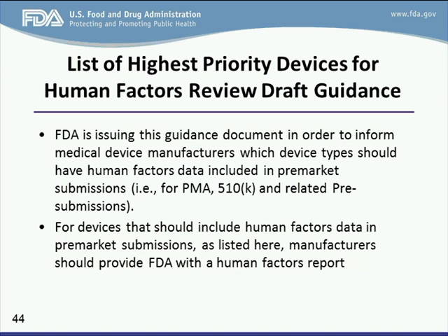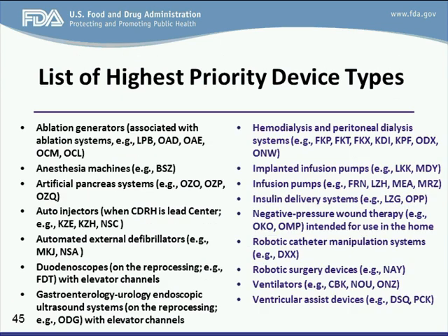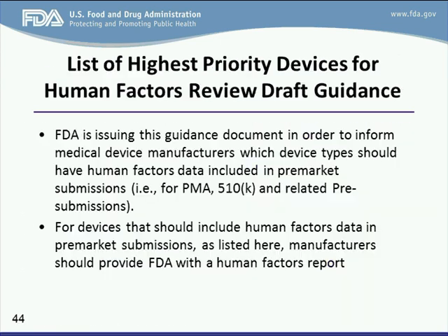So I'm going to walk you through the rest of the presentation, which is the list of the highest priority devices for human factors review. As you are aware, medical devices are considered one of the safety critical technologies, and the expectation is that human factors validation testing should be part of your robust design control process.